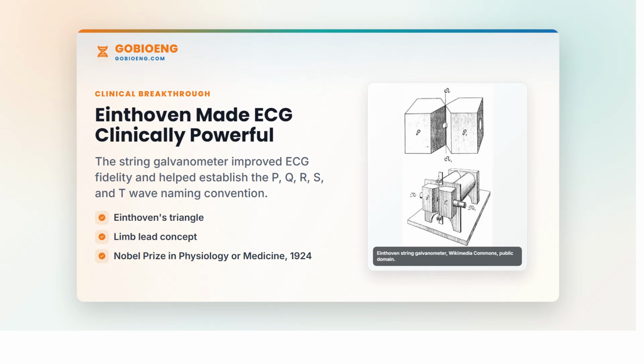Another interesting part of ECG history is telemedicine. In 1906, Einthoven described telecardiograms. Patients were in a hospital several kilometers away, and ECG signals were sent to his laboratory. In simple terms, the heart signal traveled before the ECG machine became small enough to sit everywhere.